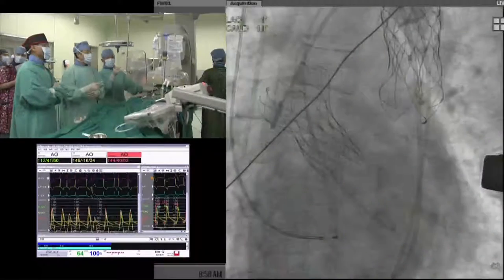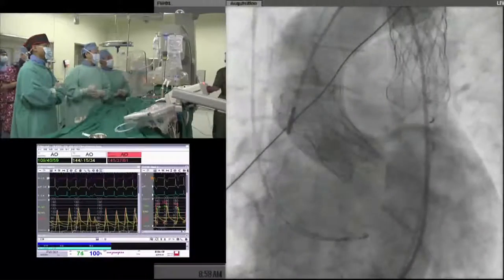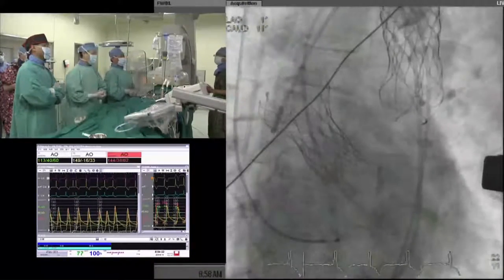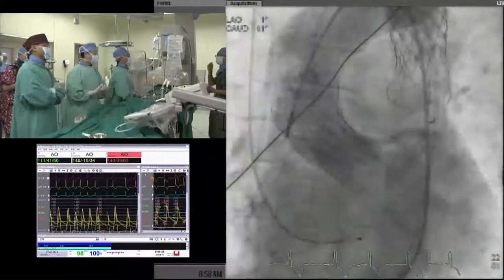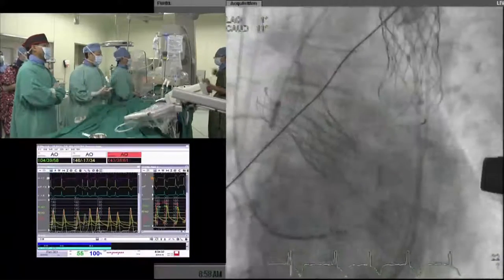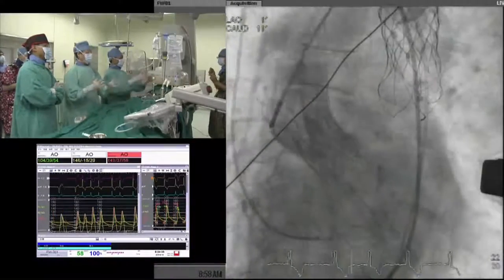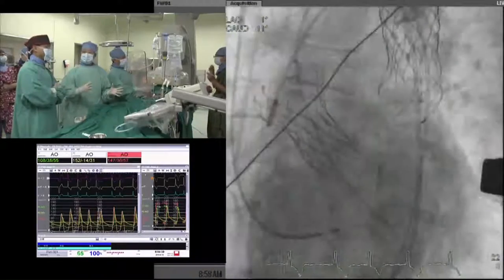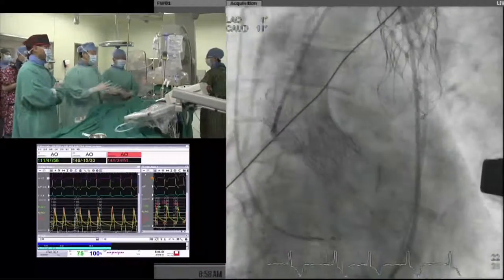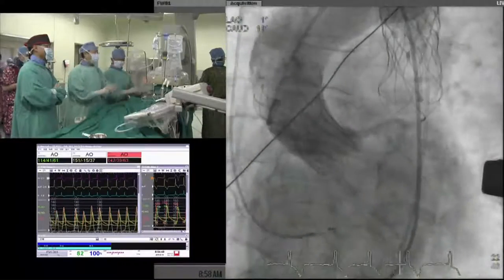Okay, 20, right? Ready. This is the aortic angiogram. Look, just a small trivial leak. I think the shape of the valve was not correct a moment ago. This time the shape of the valve is quite good, because with time it has fully expanded. Also, because of severe calcification, it's difficult, almost impossible, for it to move anymore. I would say this is stable there.